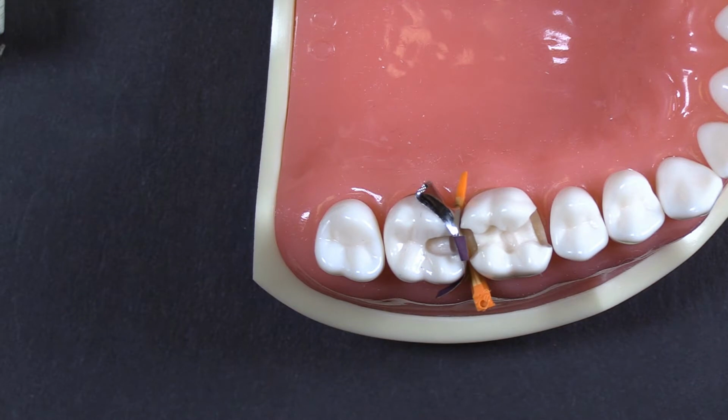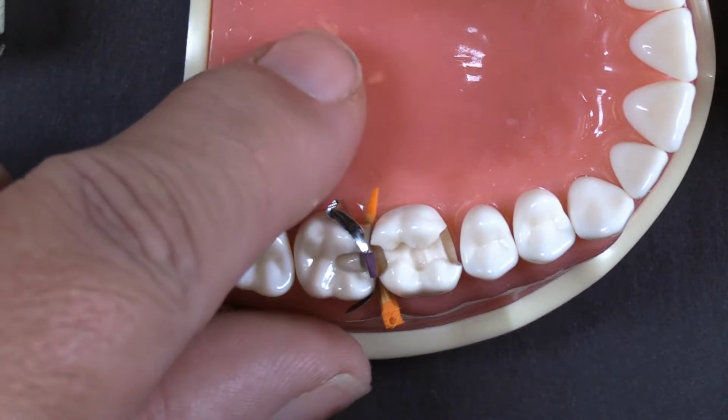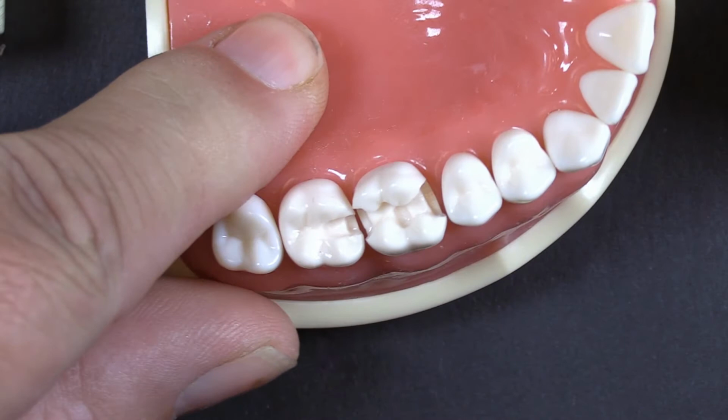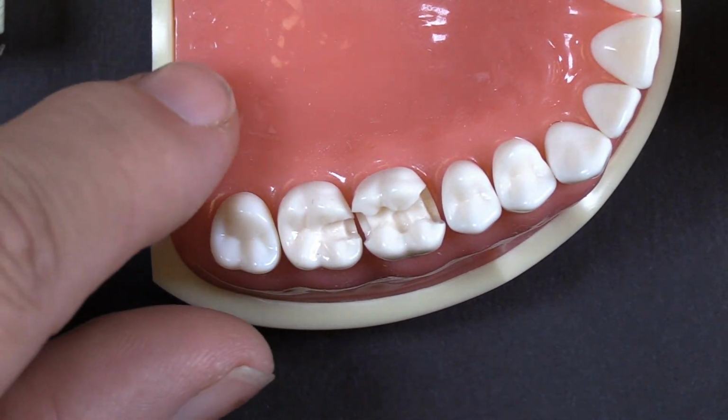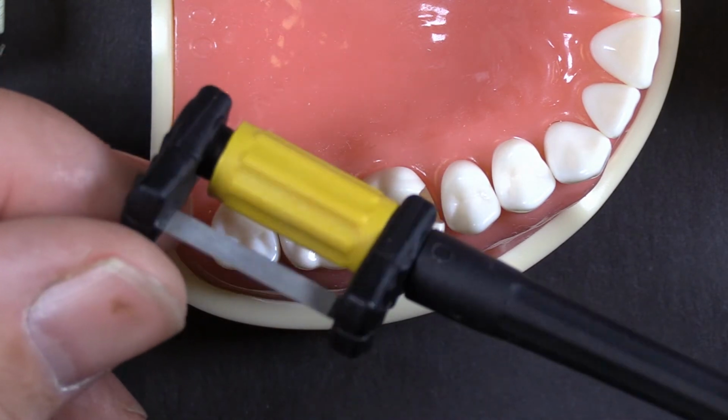So now if you have an overhang, what do you do? The interproximal finishing is a bit of a booger. It's hard to get instrumentation down in there. There was last year, wasn't it? We came out with Fit Strips, which are an interproximal finisher.